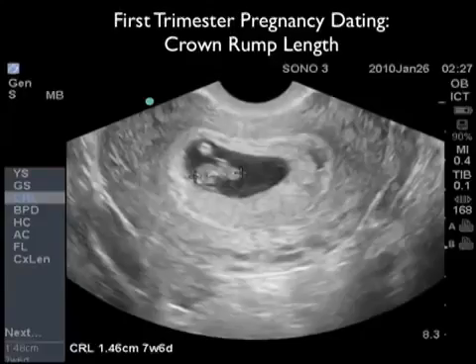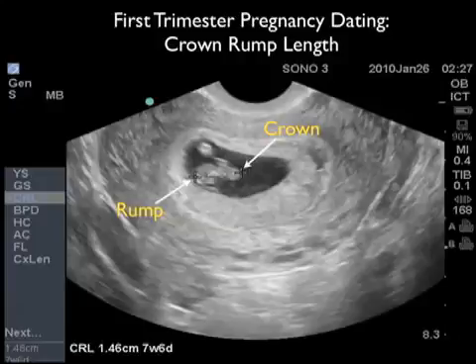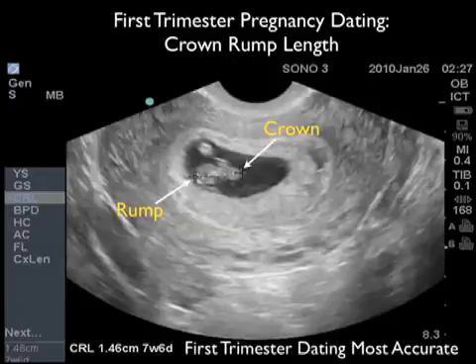This is an image of a first trimester pregnancy, and we're going to evaluate the gestational age by measuring the crown rump length. Here we see the fetal pole stretched across the gestational sac, and we see the crown located over towards the right and the rump towards the left. If we put the calipers down from crown across to the rump, we get a measurement of 1.46 centimeters.